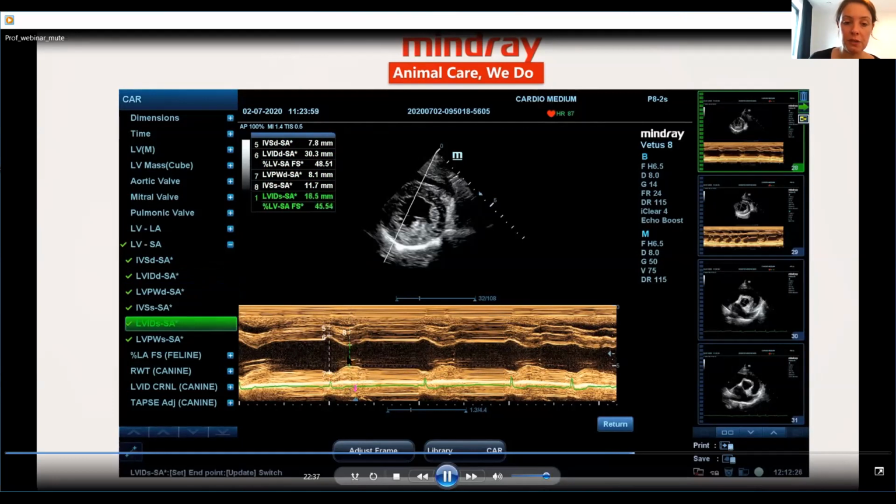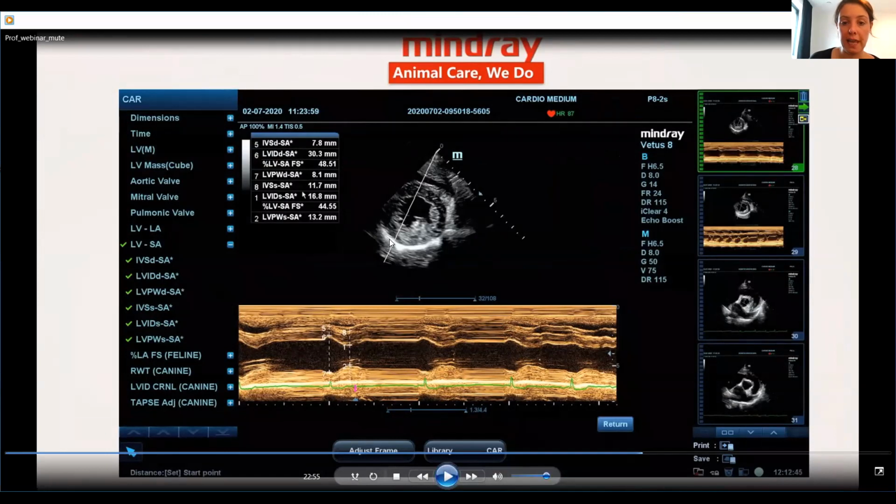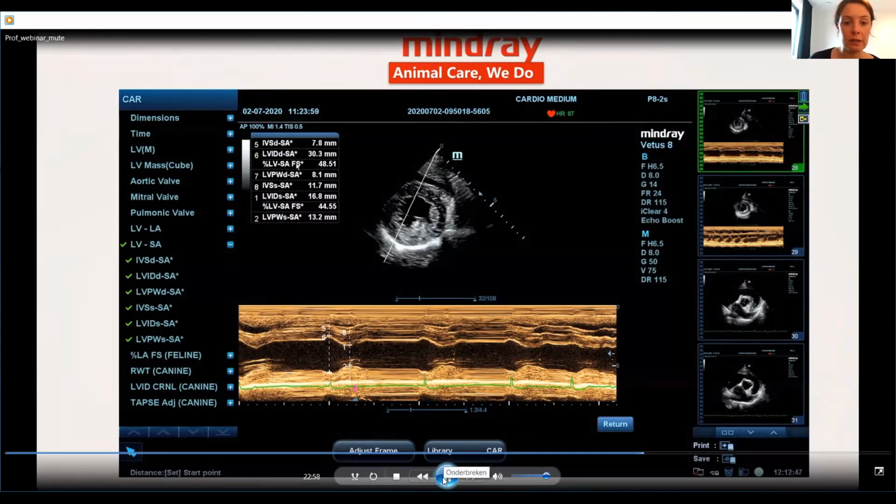Next is, after the T wave, we are here in systole. This is the thickness of the septum in systole, the lumen of the left ventricle in systole, and then the thickness of the free wall in systole. Because this is what you actually see when you put your line. The first thing you see is right ventricular free wall, then you see the lumen of the right ventricle, then you see the interventricular septum, the lumen of the left, and the free wall. So this is how you dissect your heart, and this is then how you see these structures set out over time.